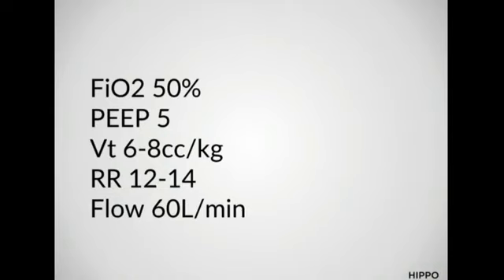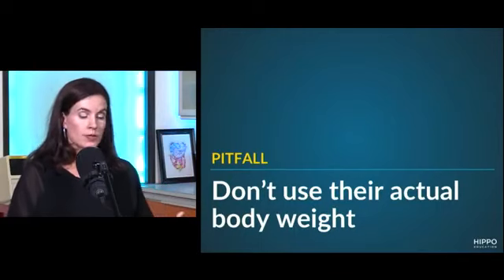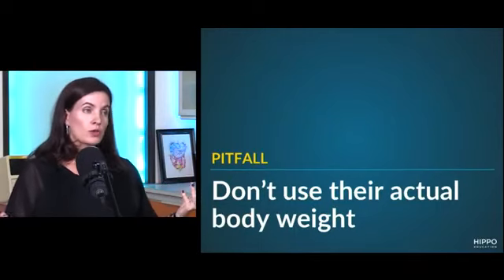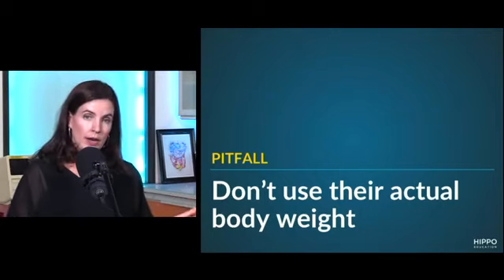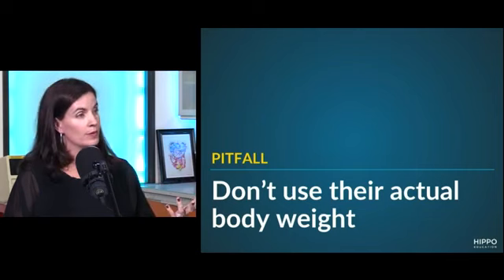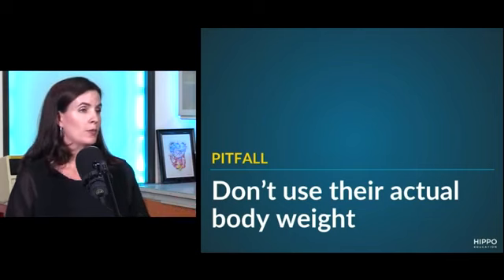So there are a few pitfalls here that we want to avoid. Number one, when you're setting their tidal volume, we don't use people's actual body weight, which is a good thing because now you don't have to ask people what they weigh, because they weren't going to tell you the honest answer anyway. But what do we use instead of their actual body weight? I'm going to assume the ideal body weight. The ideal body weight, right? So you need to know their gender and their height. That's how we calculate it. And you can just plug it into MedCalc and it'll give you their ideal or predicted body weight.